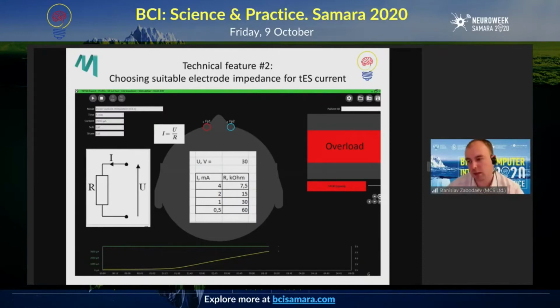your patients. Transcranial electric stimulation is sometimes reported to cause a prickling sensation in patients. And I've even heard that some people use a method to determine the maximum allowable current to be used for each patient.